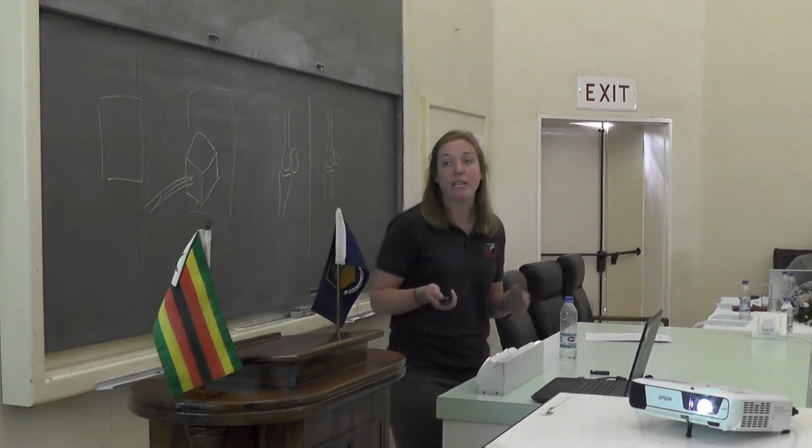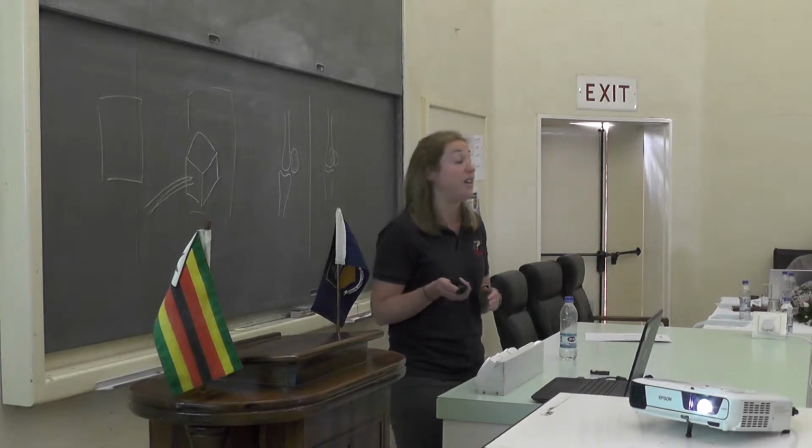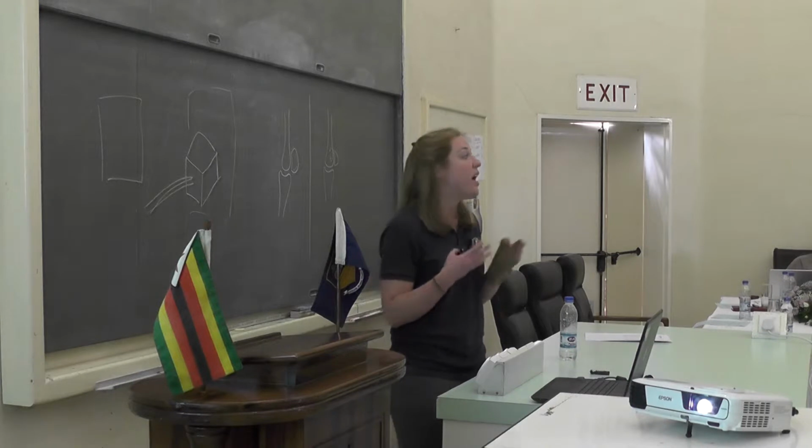You must also check your exposures and make sure everything else is correct, and obviously think of radioactive safety as well, and think about your gowns and your distances and unnecessary exposure of unnecessary people.